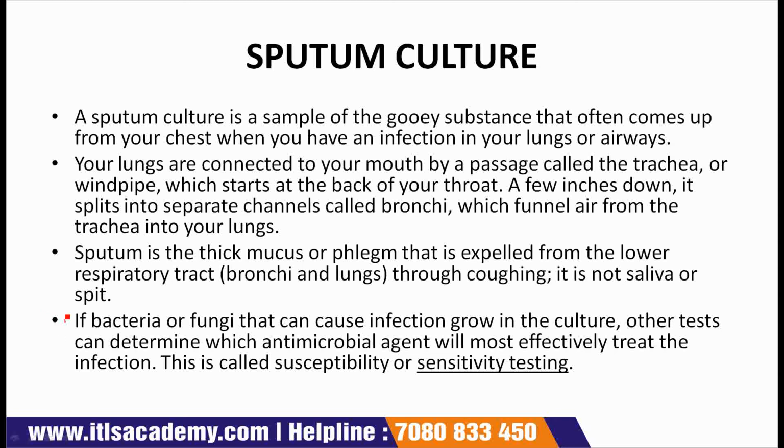Next point is if bacteria or fungi that can cause infection grow in the culture, other tests can determine which antimicrobial agent will most effectively treat the infection. This is called susceptibility or sensitivity testing.